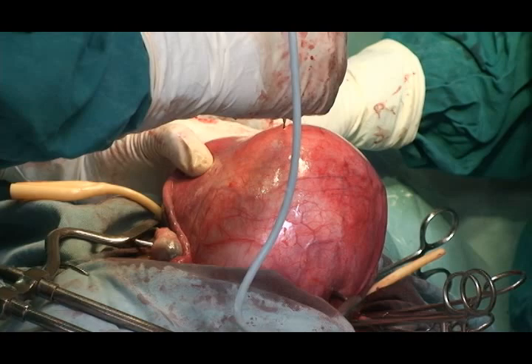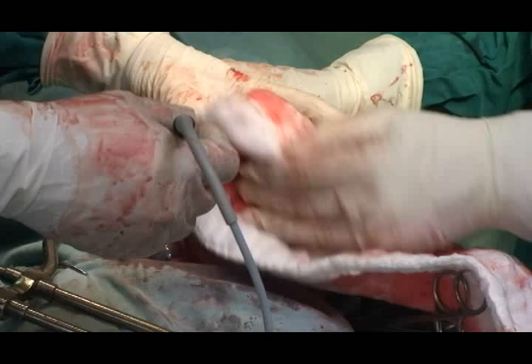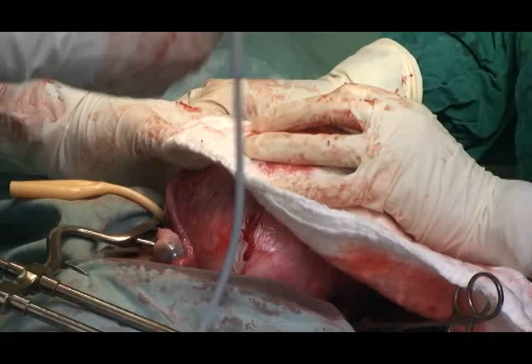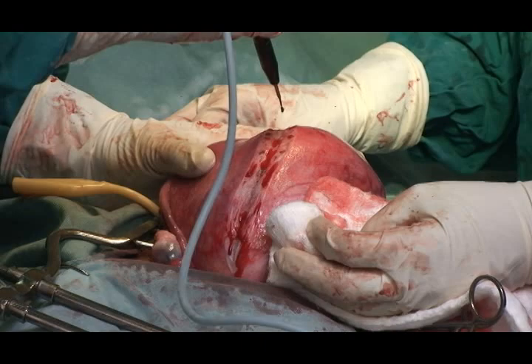The uterine incisions for myomectomy should be made using either electrocautery or a scalpel. The principle regarding the type and site of the incision is that it should be made as much as possible on the anterior aspect of the uterus, and ideally all myomas should be removed through a single incision placed on the anterior aspect.